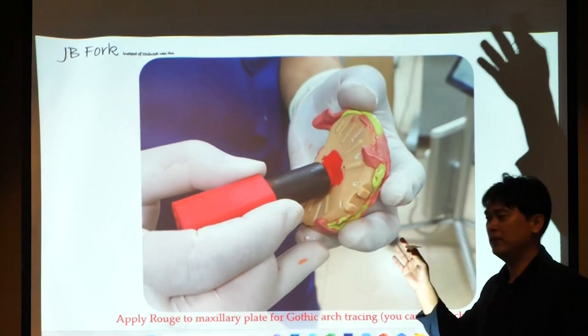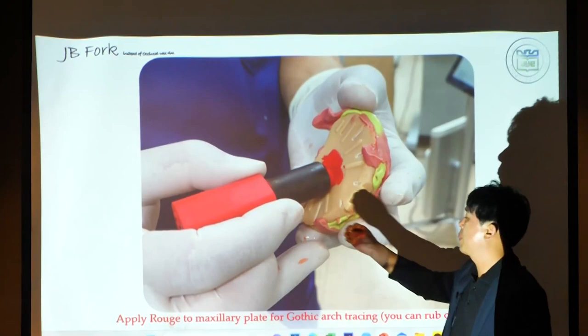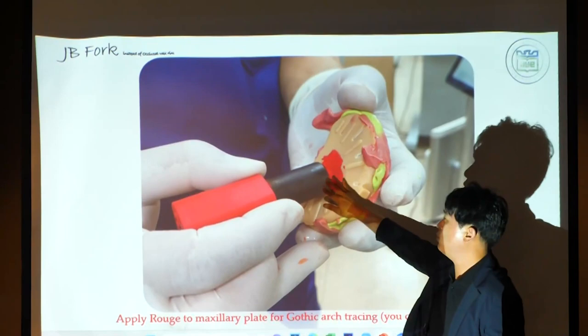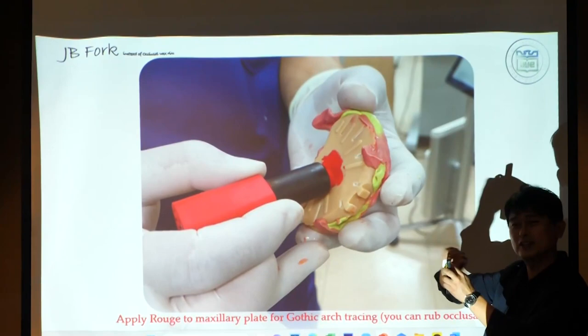And then this patient was a little bit young. So she can draw the Gothic arch tracing perfectly, you know? So in that case, it's an optional procedure. So this is rouge, lipstick. Yeah, in Korea, this lipstick is only $1. And I bought many lipsticks in my clinic, so it's best to detect the Gothic arch tracing. Anyway, if you don't have lipstick, you have to hire woman doctors, or you can use articulating paper. The articulating paper, yeah, rubbing. How can we say? Anyway, scrubbing, right? Yes, and then you can detect the Gothic arch tracing very easily.